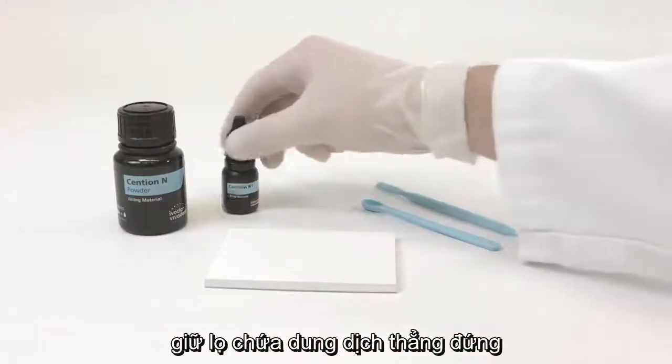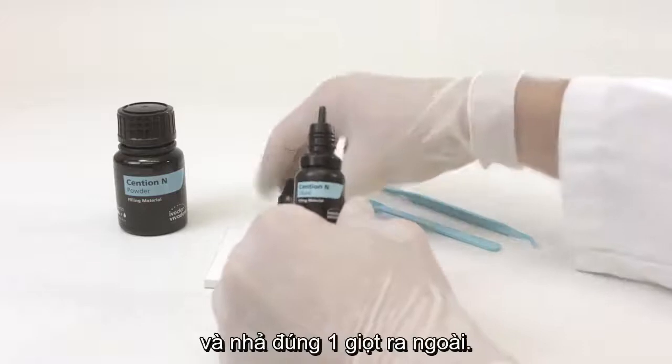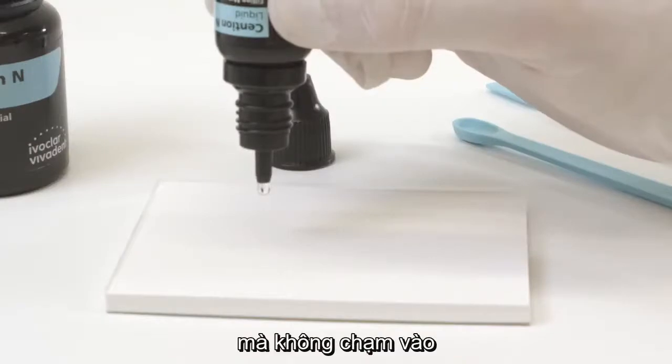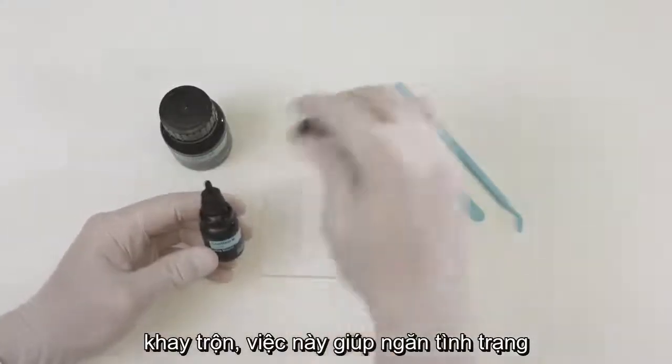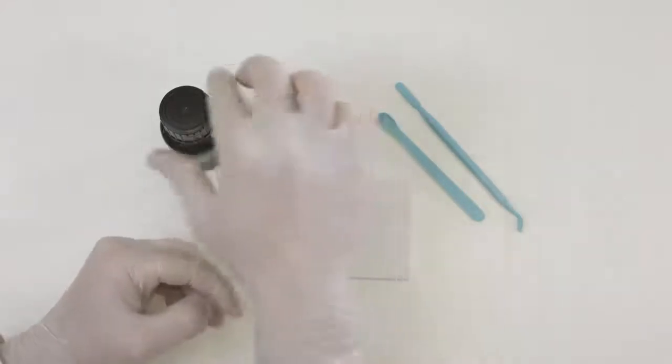Hold the bottle containing the liquid in a vertical position. Squeeze the bottle lightly and evenly to dispense one drop. Make sure that the drop separates from the bottle by itself without touching the mixing pad. This helps you prevent air bubbles from becoming enclosed in the liquid. After use, close the bottle tightly.